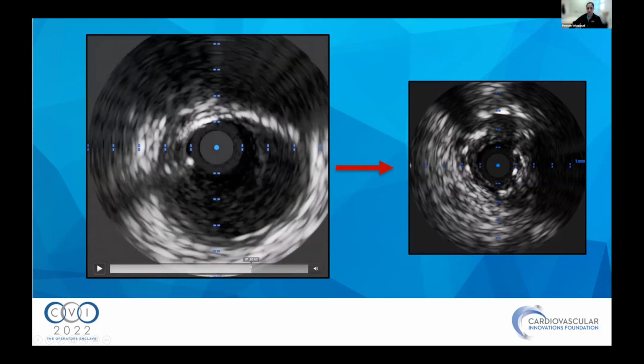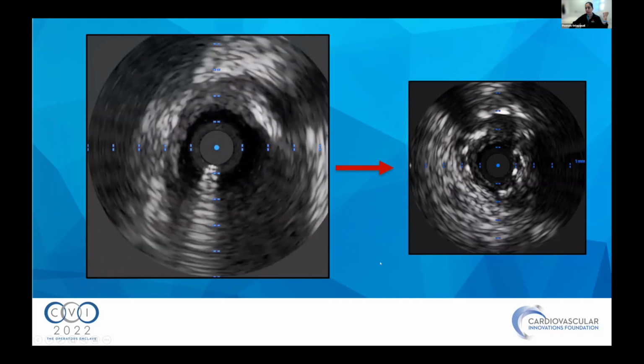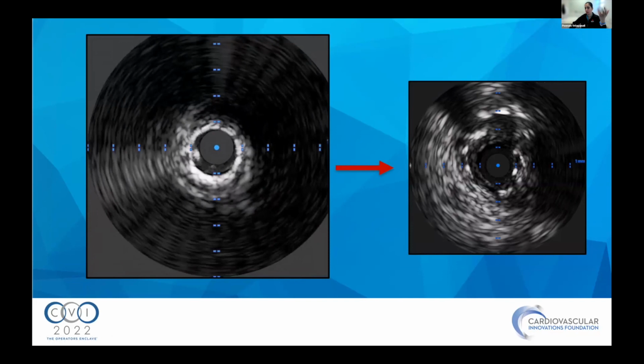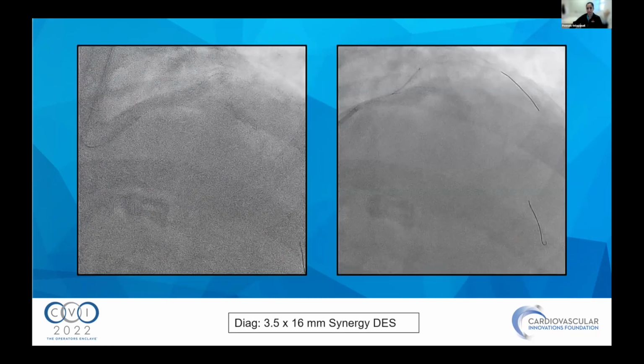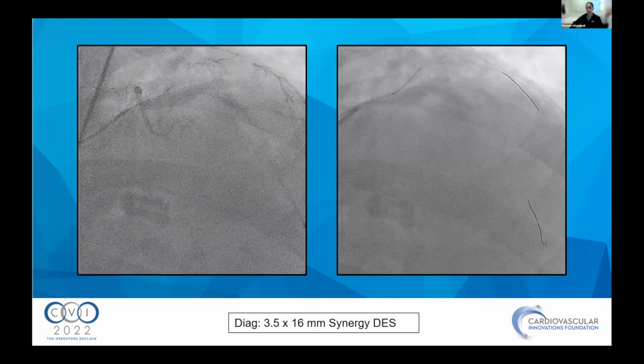And so, like I said, if it was a mechanical problem, we thought we could always fix it this time. And then if he has a problem, he's still a candidate for CABG in future. So stent sizing, both diag and LAD were 3.5, distally as well as proximally. And so from here on, it was straightforward.